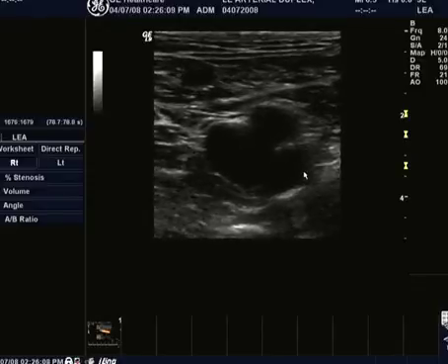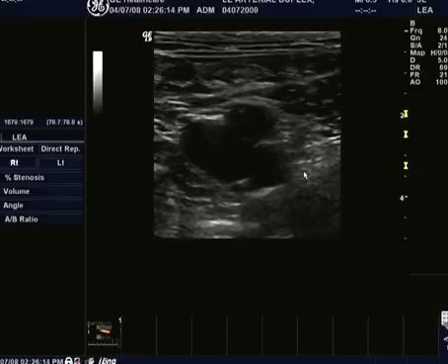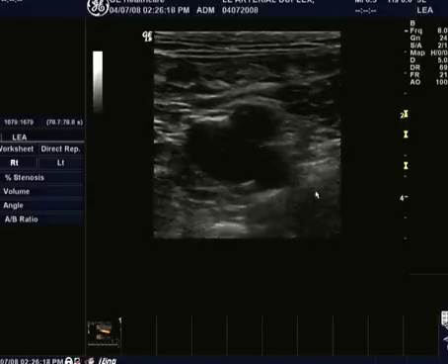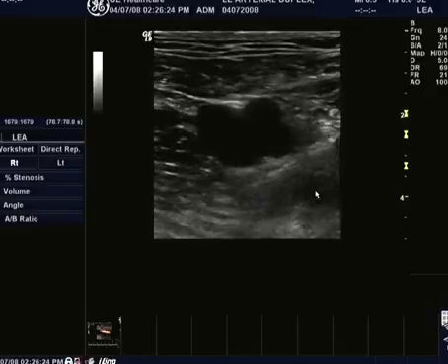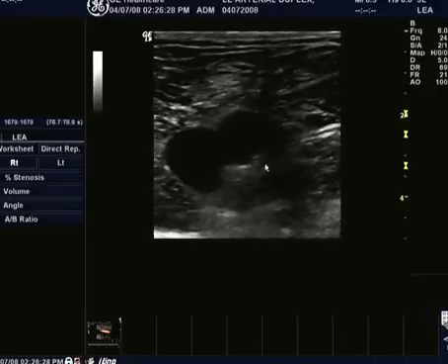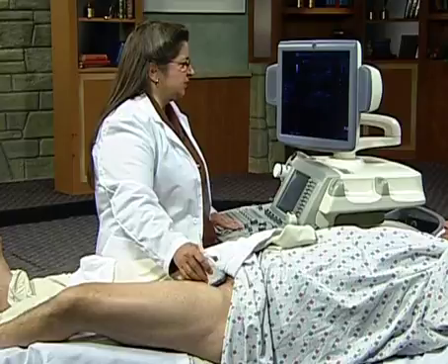And I think you really need to be able to appreciate this on the grayscale image first, get oriented to the surrounding tissue and what landmarks or other objects you may see, and then if you want to quicken your exam or you need a little bit of assistance, then you can throw the color in as a guide. So we're going to come back up to the common femoral artery, and at this point I'm going to rotate the transducer into a longitudinal or sagittal view.